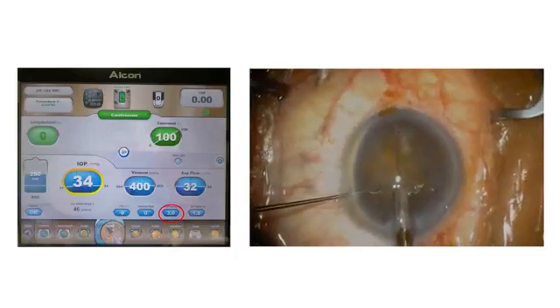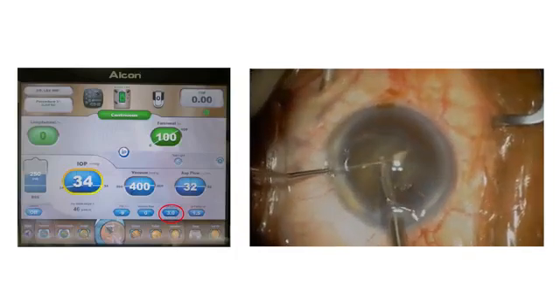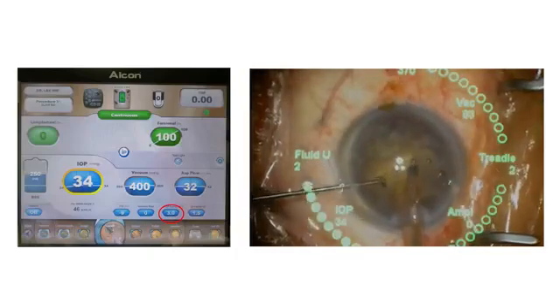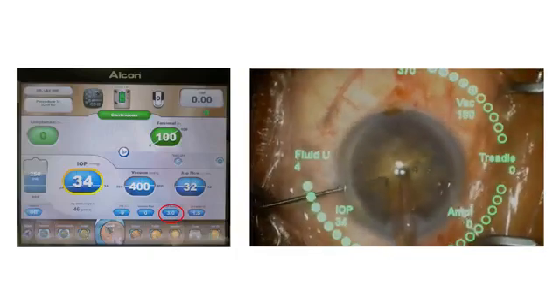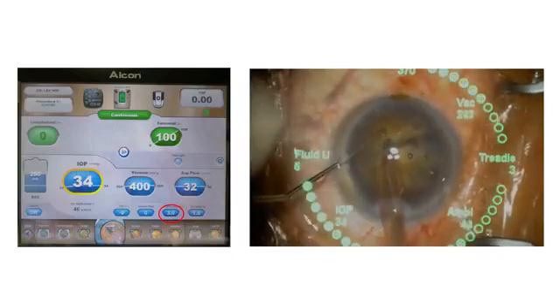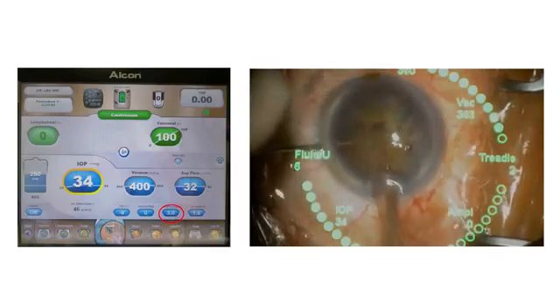And what I've highlighted here is the IOP ramp, which goes up to about 3, which is the maximum. This just means that the fluid is pushed into the eye more gradually. And as you see in the video, you don't get that sudden expansion of the pupil when the reverse pupillary block happens. So this is also a high myope with a relatively dense cataract.